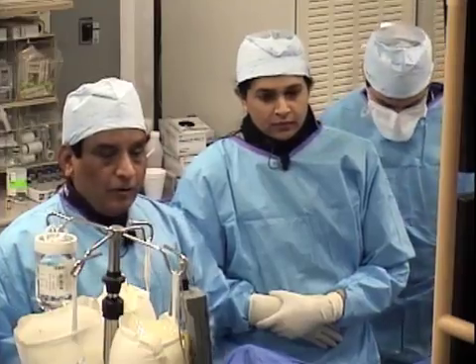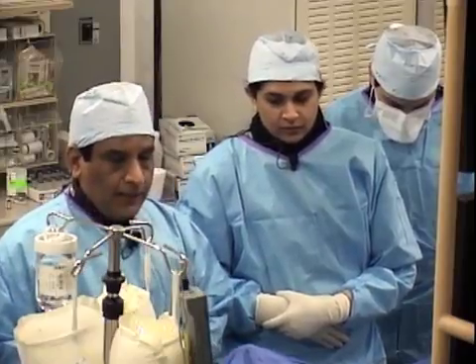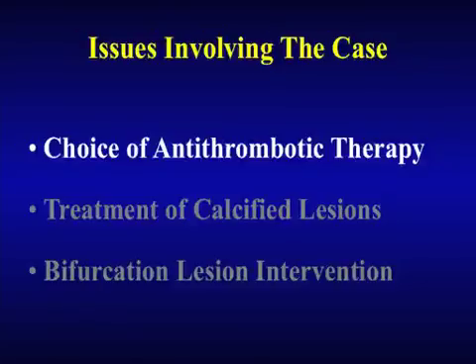Excellent. Now with that note, let's quickly go while we are getting ready. As I mentioned, about 10 minutes, I'll try to do it a little quickly. The key is that all these slides will be available on the website, so that anybody can download them later on. Issues with this particular case are threefold: choice of antithrombotic therapy, treatment of calcific lesions, and the bifurcation lesion intervention. And I'll focus more on the calcification in this particular case.